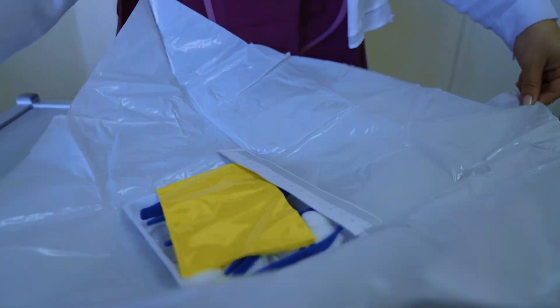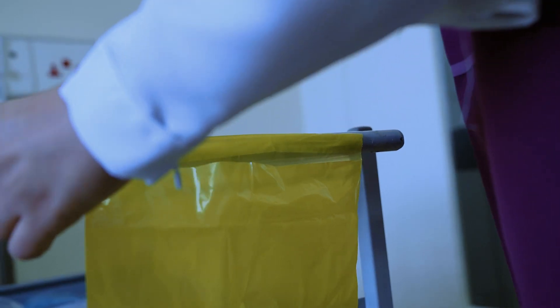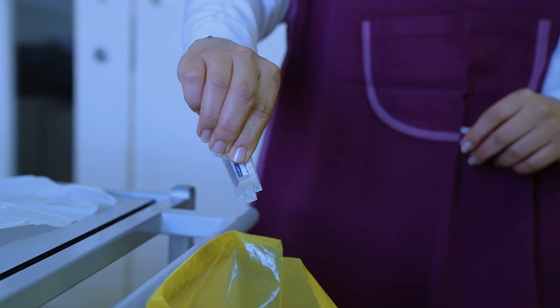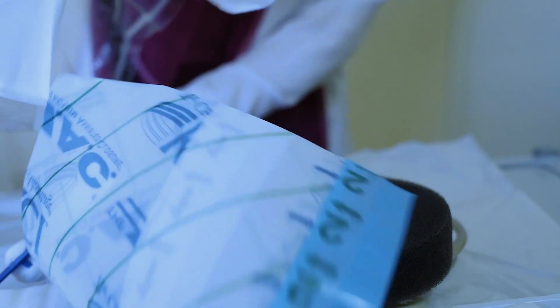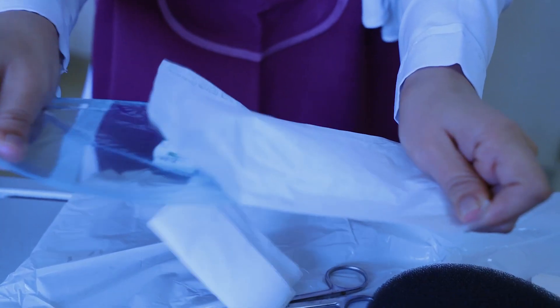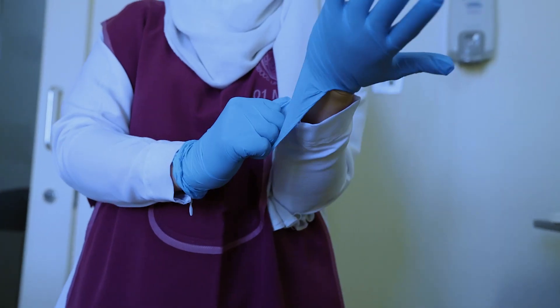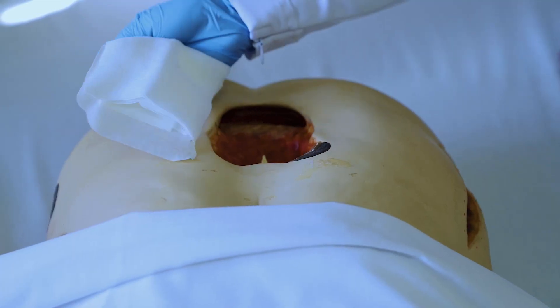Open the dressing pack, attach the yellow disposable bag, pour normal saline, open the VAC dressing kit, sterile scissors, and sterile gauze.